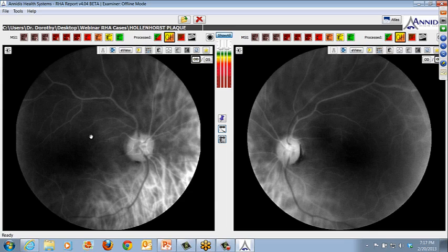Sometimes, in some cases, you can get a larger Hollenhorst plaque that's in the posterior vessel, just anterior to the lamina cribrosa, and it could momentarily block blood flow or, in fact, block blood flow. But typically these are non-occlusive, and you can actually see that, and it's validated on the oxymap because there's certainly blood flow past the plaque. If this were a fibrin or calcific plaque, which of course localizes to a slightly different area in the cardiovascular system typically, then you would see potentially some occlusion.